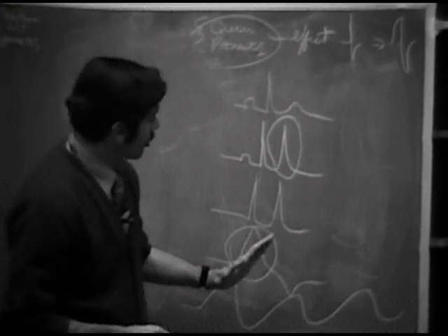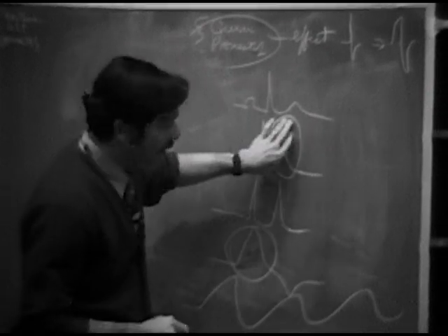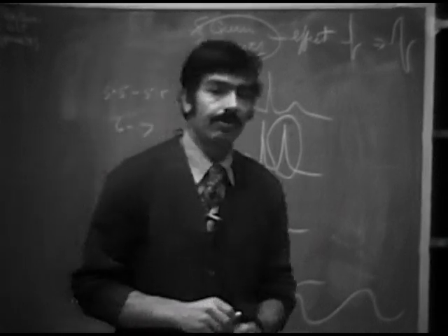But the important thing to remember is the 2 ways that these patients present clinically are, one is the T-wave peaking, and the other is the intraventricular block, or the wide QRS complex.